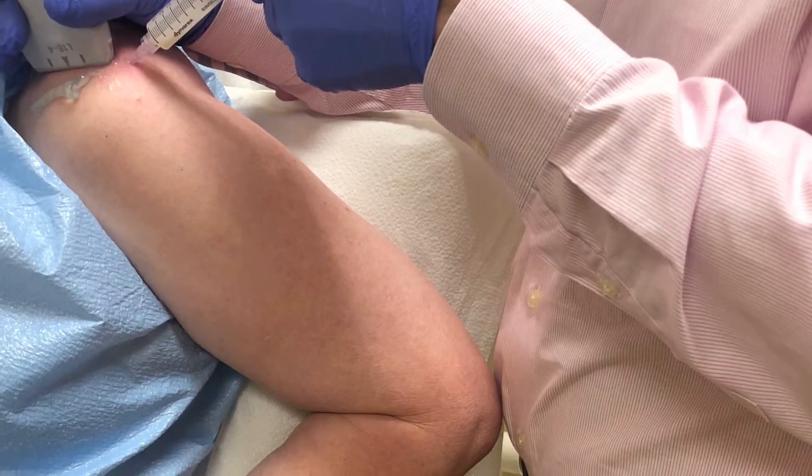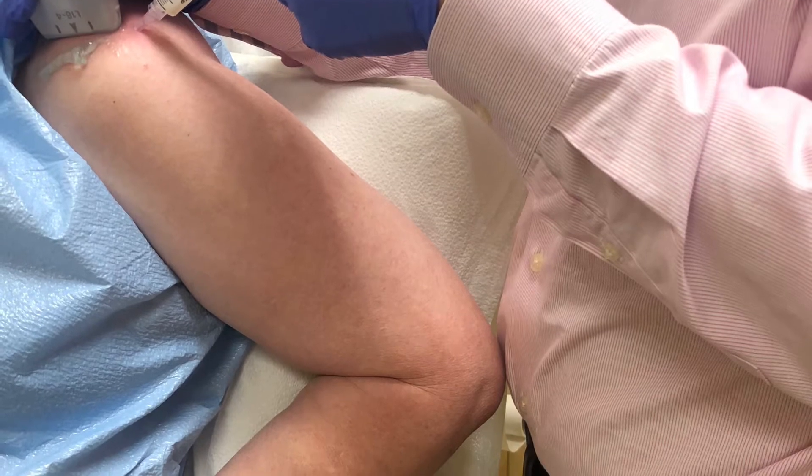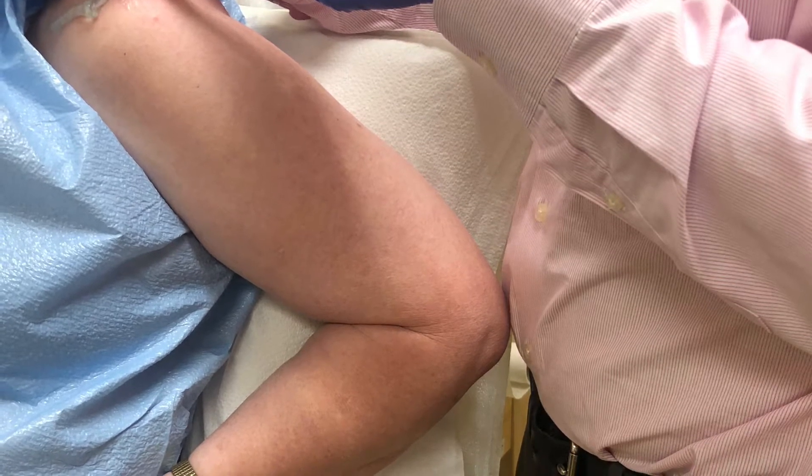Here you can see how the patient is positioned for the procedure, with her hand on her hip and her elbow backwards. This brings the deposit more towards the front for easier visualization.